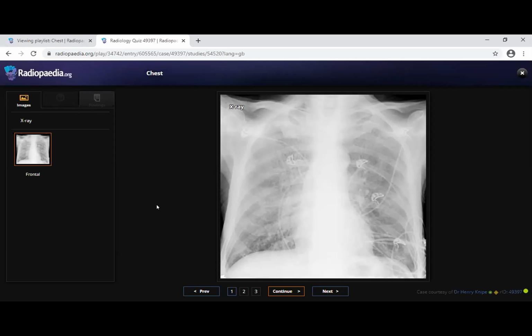He has history of fever, yes. If the patient has history of HIV, could be pneumocystis jirovecii pneumonia, pneumocystis carinii pneumonia. Differential diagnosis is pulmonary hemorrhage, but no history of trauma.